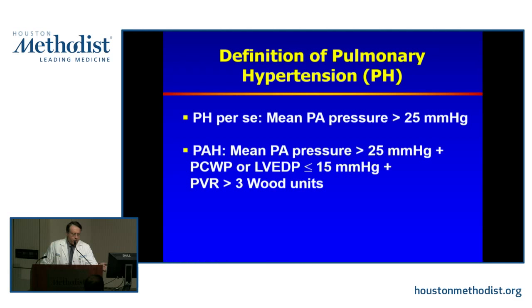From an echo point of view, then you say, I want to be able to say what the mean PA pressure is.